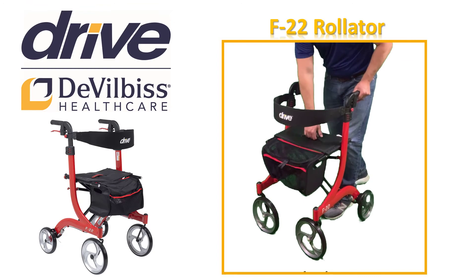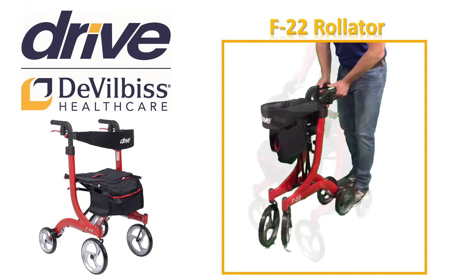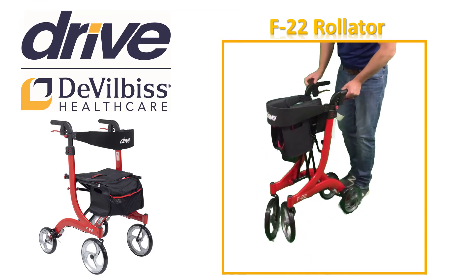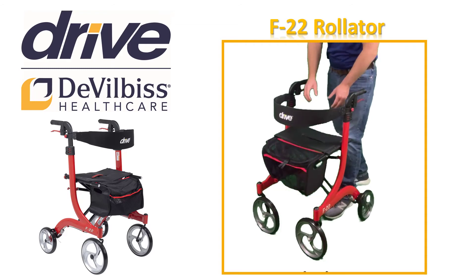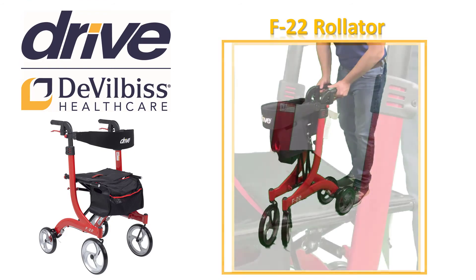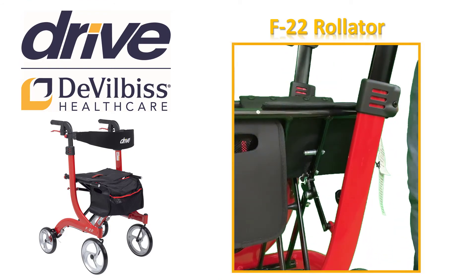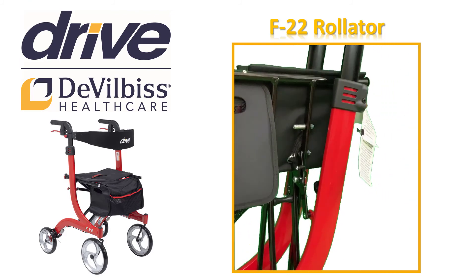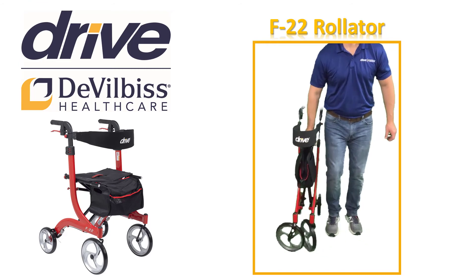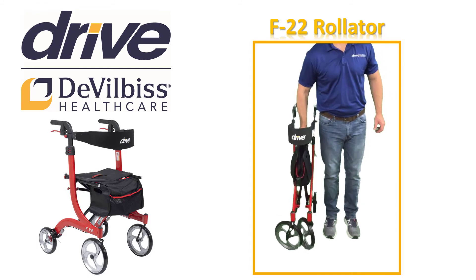When you are finished using your F22 Rollator, you can close the Rollator for storage while not in use. To fold, pull the seat upwards by the handle strap in the middle of the seat. The F22 Rollator can now be folded completely and securely by pushing the hand grips together. Remember to listen for the audible click which confirms that the under seat locking mechanism is engaged and the F22 is locked into the folded position. See how little space your F22 Rollator takes up when folded into the locked position. The F22 Rollator is that simple to use and store.